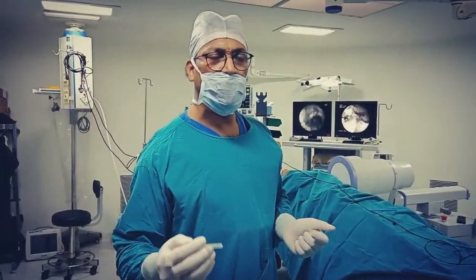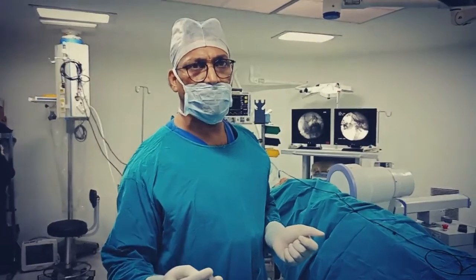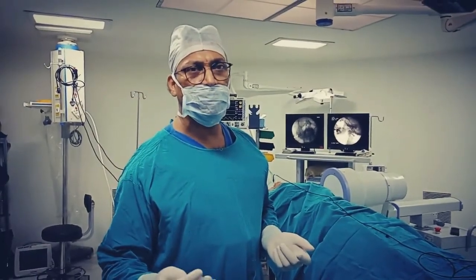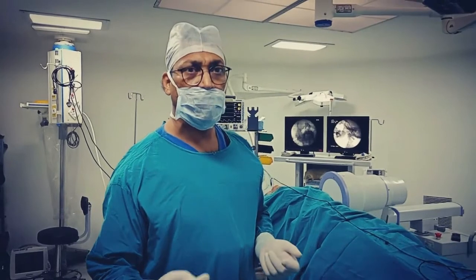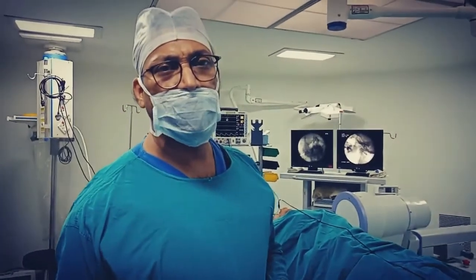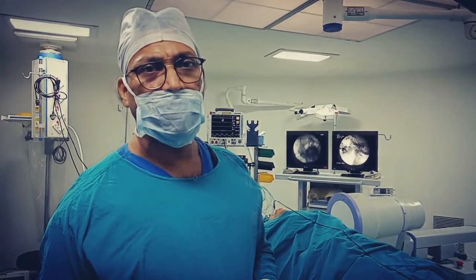We got sensory stimulation at 0.3 mA and motor stimulation at 0.4 mA. We are now very close to the mandibular nerve.